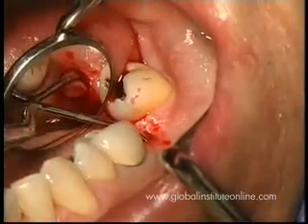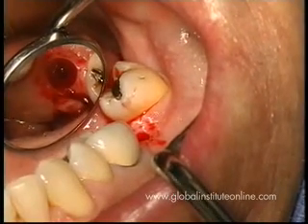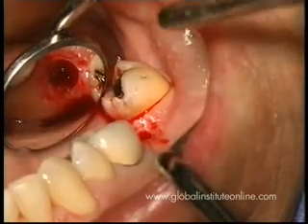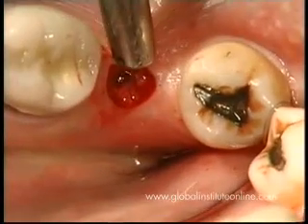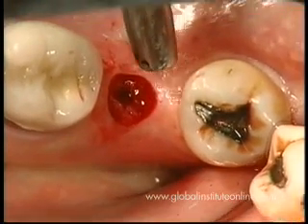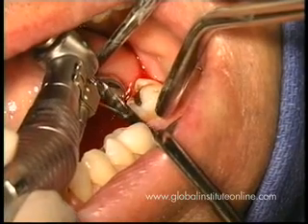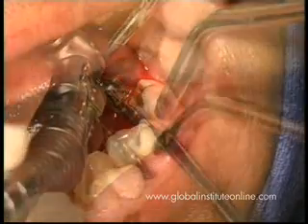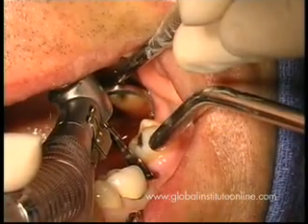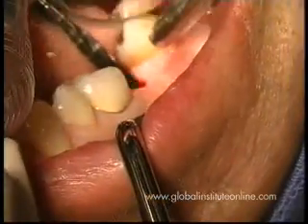A surgical spoon can be utilized as a removal tool for this gingival tissue, and a clean entrance to the bone is now demonstrated. Some extra soft tissue can be removed with a small scalpel or with a curette. The next drilling procedure now just follows the drilling of preference, either following the industry's guidance or the preference of the clinician.